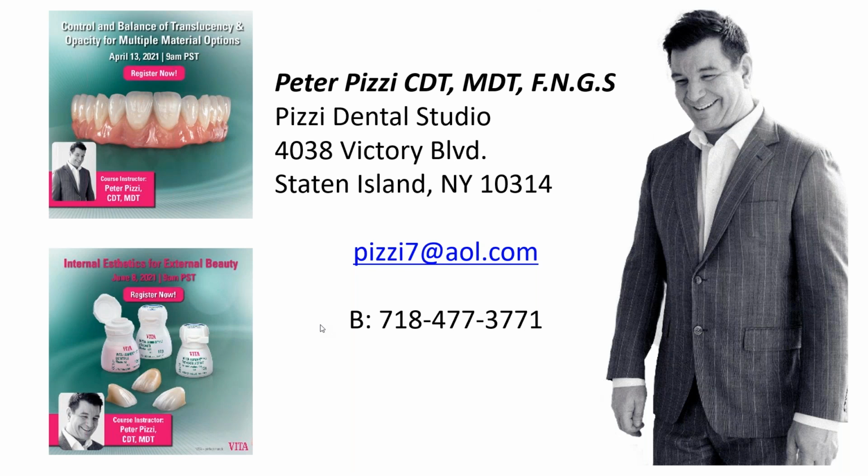that's where I have to really learn to make the adjustments on how I'm viewing what I'm seeing in the camera lens, because the camera lens is a mechanical device, it's not your eye. So you're compensating for what you see based on a reference point of a shade tab, based on the reference point of an Easy Shade or an Opti Shade, to make yourself adjust to the build-up process to make it work.